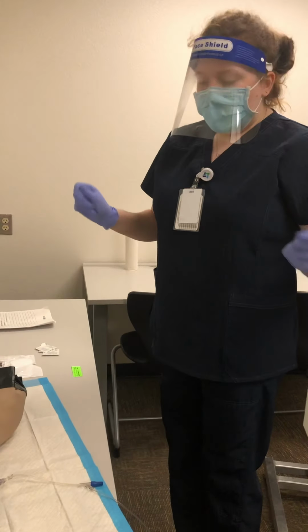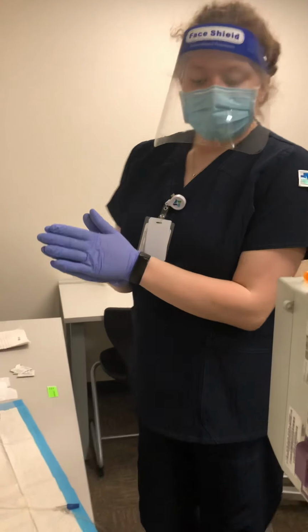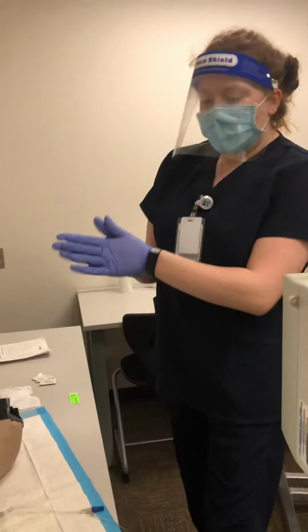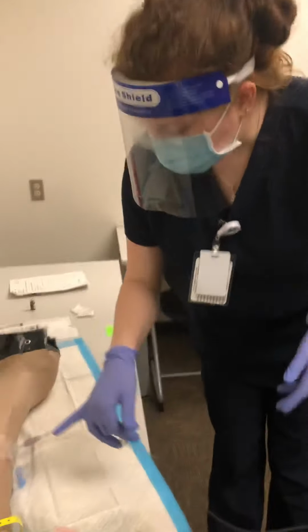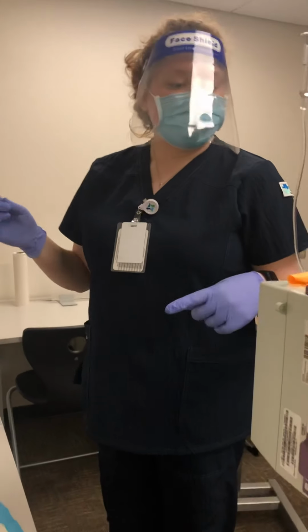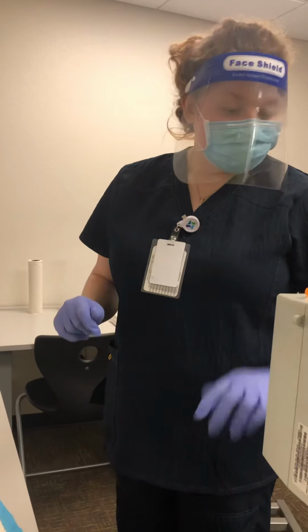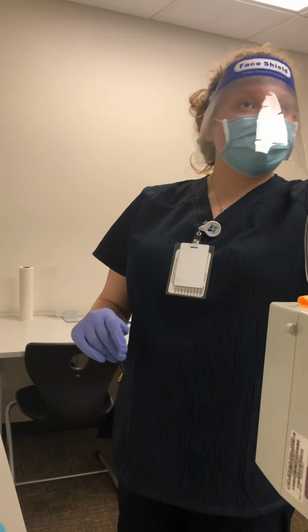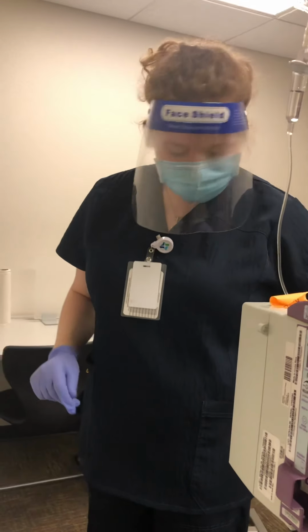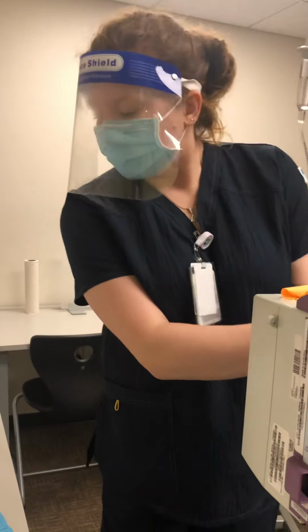Okay, Shirley, do hand hygiene, put on brand new gloves, and get your name and date of birth and your allergies, okay? We do both. All right, so I'm just looking at the IV site. We've already assessed her pain after that 30-minute mark, and it was at 3 out of 10, so that's good. That's within her acceptable pain rate. So I'm just going to see how much the correct amount was infused, and it was. So I'm going to stop the infusion, and right here, 2.